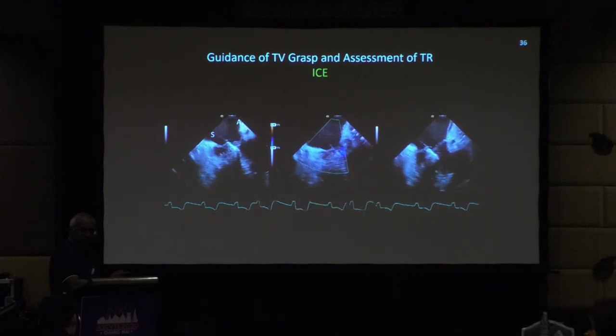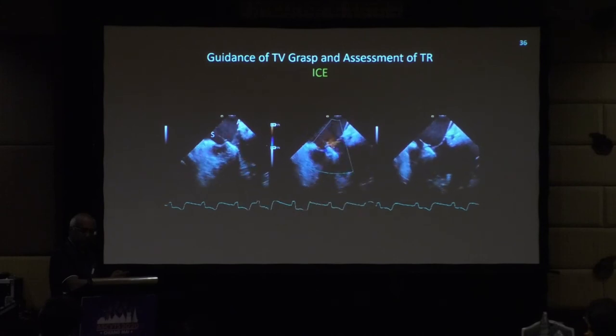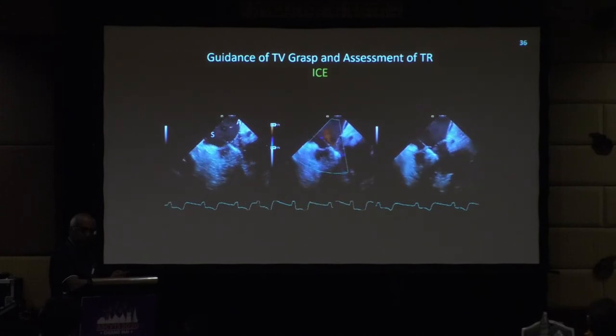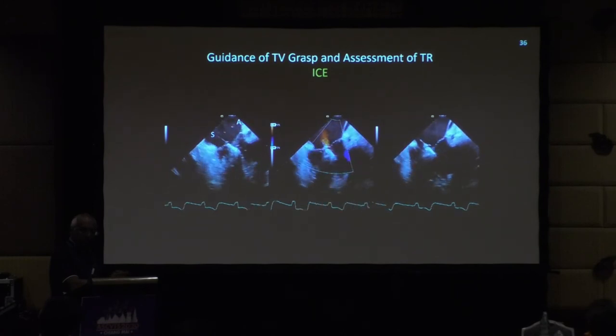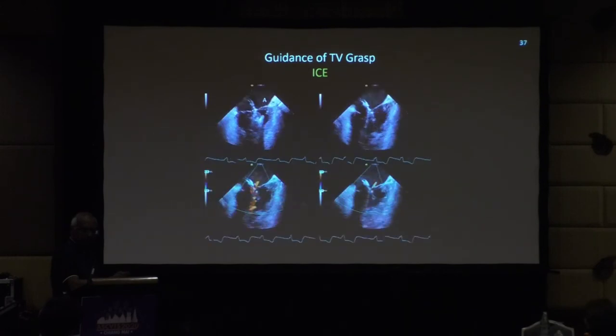We do this routinely now, and we do TEEs because the 3D portion of the TEE is essential to understand the location of the clips. But in terms of grasping, we do switch over to ICE. And our hope is that ICE would become an exclusive way of doing things so that you don't have to sedate these patients with general anesthesia. Maybe conscious sedation would do during clip procedures. Not in everybody, but at least in selected patients.